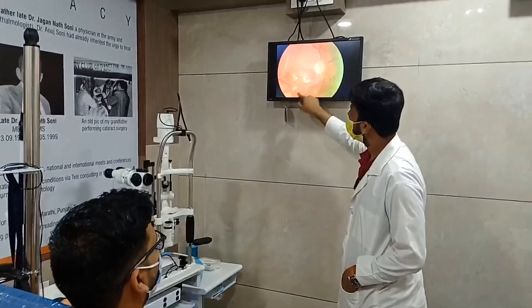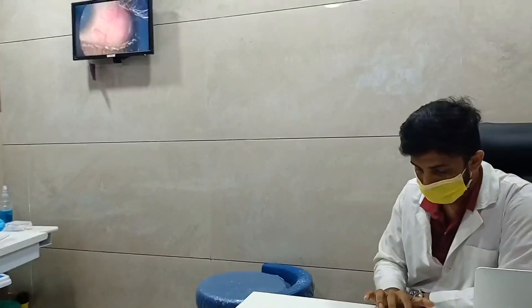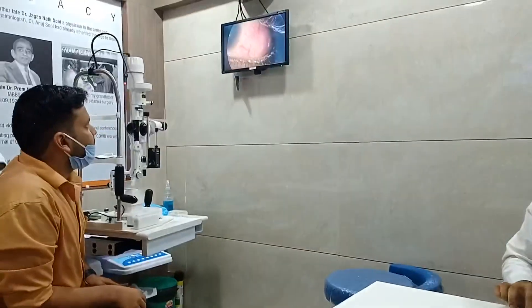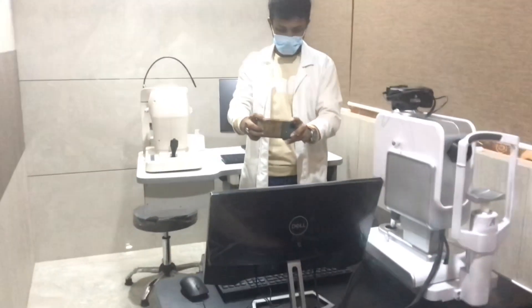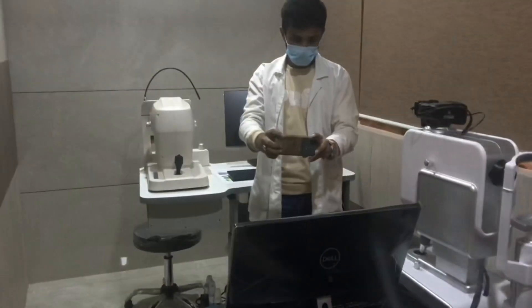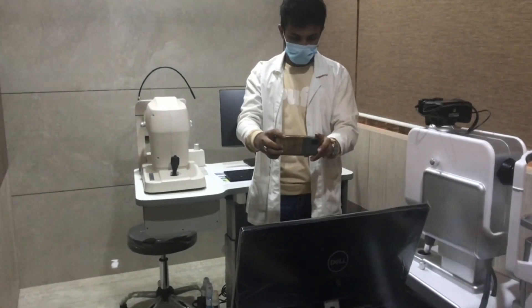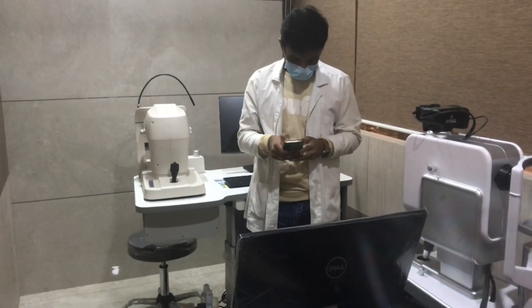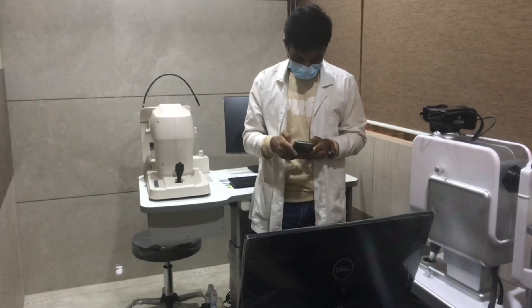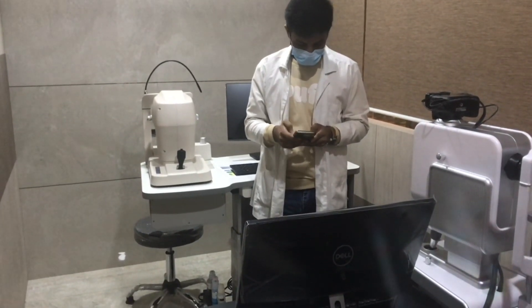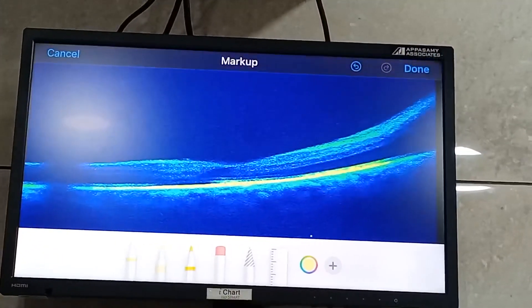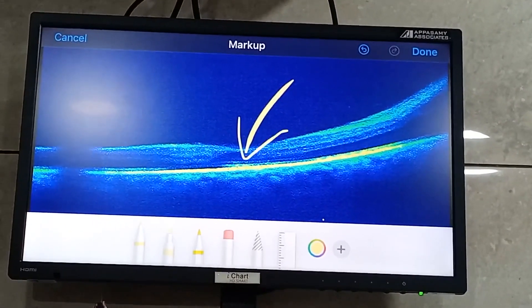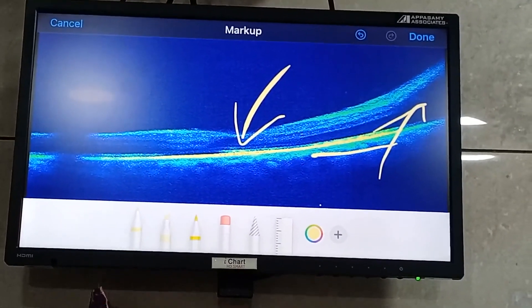You don't need to stand — you can sit and explain. This connection is wireless from your mobile to the screen. All you need to do is ask your assistant to click a photo of the fundus or the OCT and send it to you on WhatsApp. Within seconds you receive the image, and now you can zoom in and explain it with all your artistry.